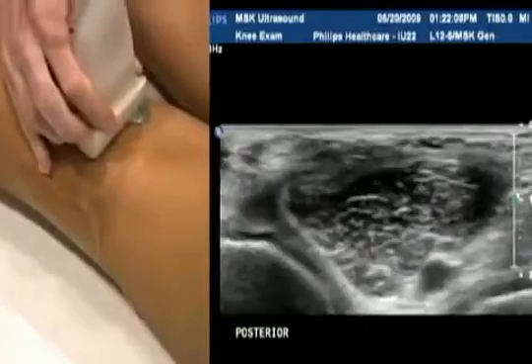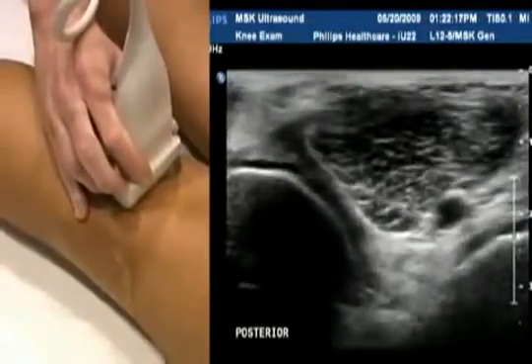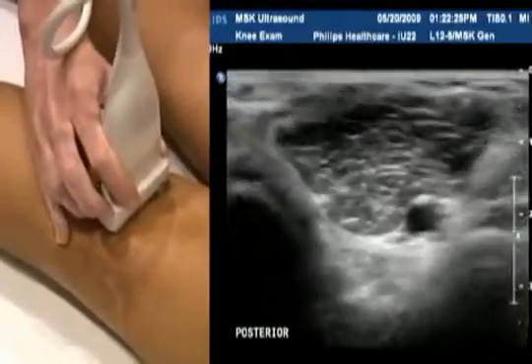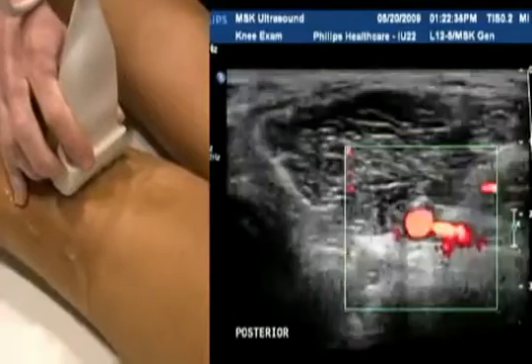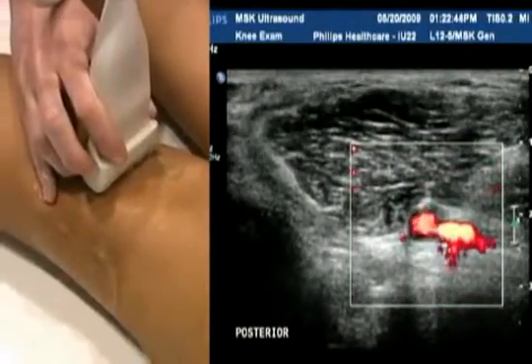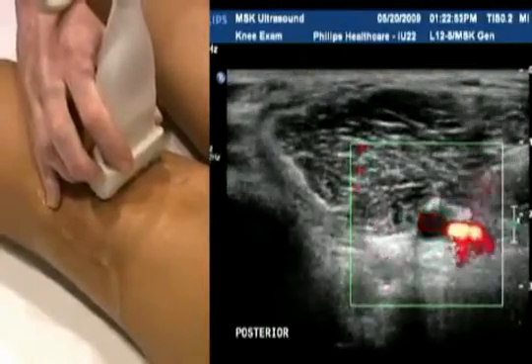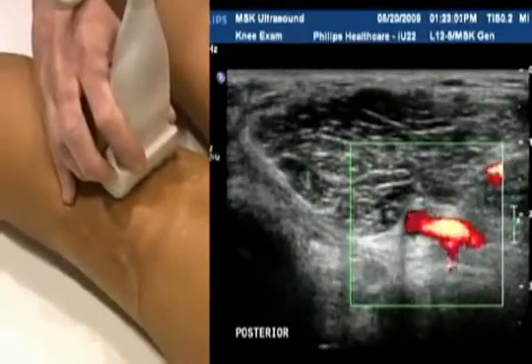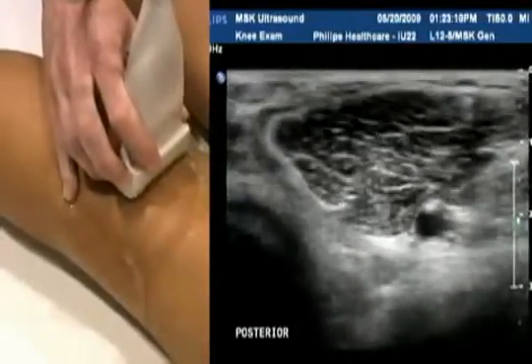Posteriorly now, you can see the tibia, fibula, and the deep structures — including the popliteal artery pulsing away. As a corollary to your study, it's a good idea to scan through that small portion of the popliteal artery. You can assess using colour Doppler or power Doppler. You can see the artery pulsing and the vein next door. Extending your study a little further gives the radiologists more information: you can assess the popliteal artery for aneurysm, for any plaque, and the vein for any thrombosis, making sure the vein is easily compressible as part of your deep venous thrombosis study that most sonographers would be familiar with.